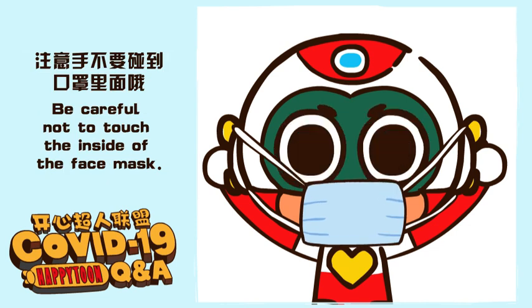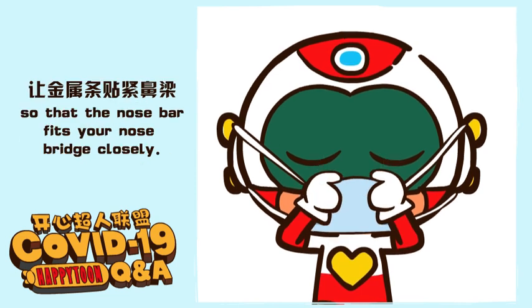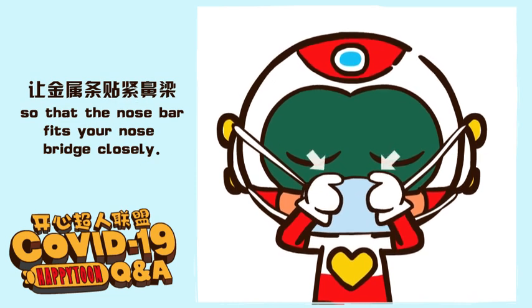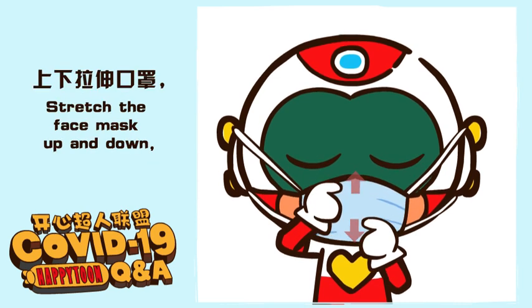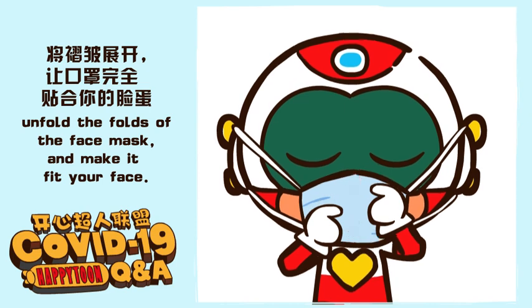Be careful not to touch the inside of the face mask. Then press the metal nose bar on both sides of your nose with your hands so that the nose bar fits your nose bridge closely. Stretch the face mask up and down, unfold the folds of the face mask, and make it fit your face.